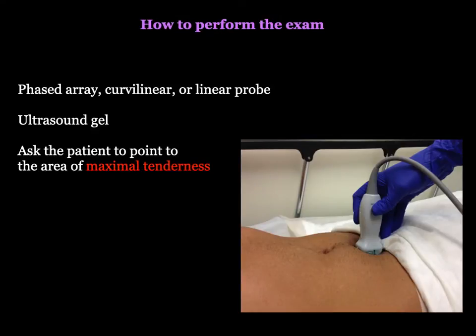So how do we perform this exam? This again is much more similar to our exam for appendicitis. We can use a phased array, a curvilinear, or even a linear probe if a patient is very thin.